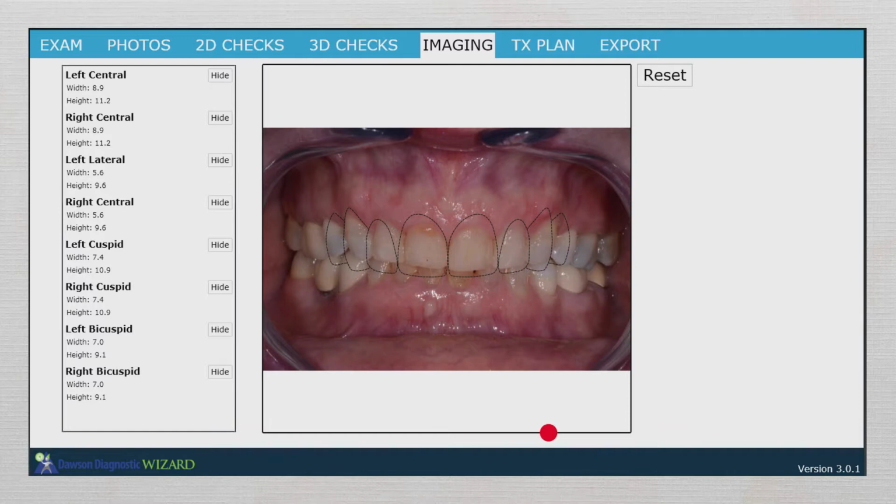I've done this a number of ways before. I've done what we refer to as that lab presentation wax up. I really don't feel that you need that. We as dentists love that, the pink wax, and we can change the teeth and the color and the shading and everything else. I just don't think patients get that as much. I will frequently do full imaging where we take these outlines and fill it in with the two shades, et cetera. But lots of times just for the discussion, these outlines are enough for the patient to get it. Absolutely.